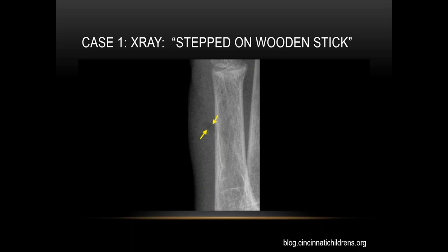Here are a couple of cases of radiolucent foreign bodies on x-ray. In this first case, we have an image of a foot. Without the yellow arrows pointing out the subtle area of lucency, most of us would not appreciate the foreign body in this patient with a history of stepping on a wooden stick. It may just look like gas or fat, so something to be aware of.